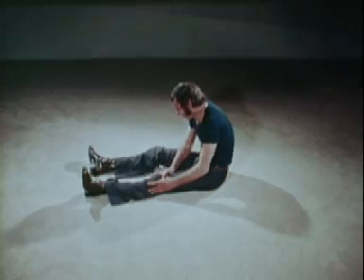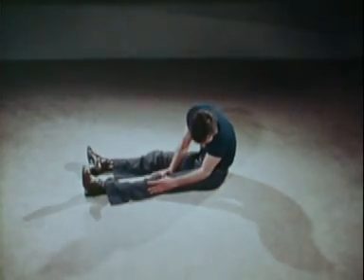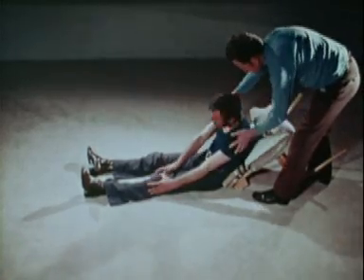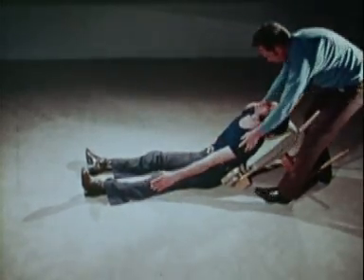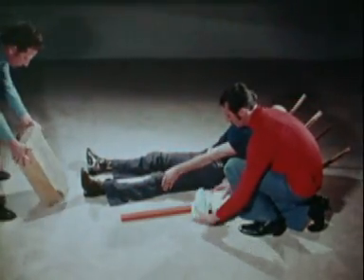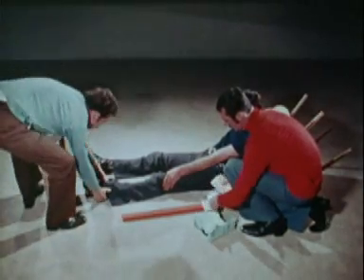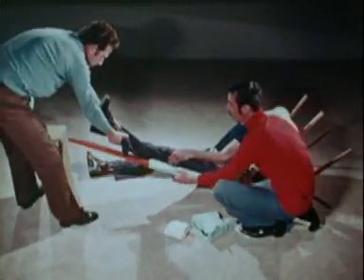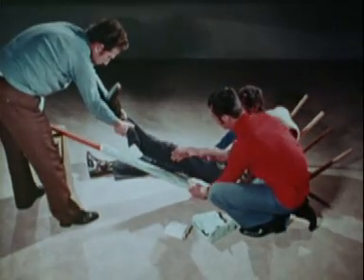In fractures of the patella, keep the patient's head and trunk well raised using, for example, a well padded chair turned upside down. Place a padded splint below the injured limb extending from the buttock to the heel. Keep the lower end of the splint well raised with a box or other form of support.